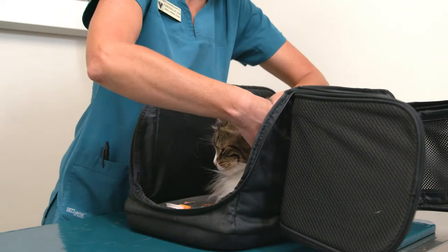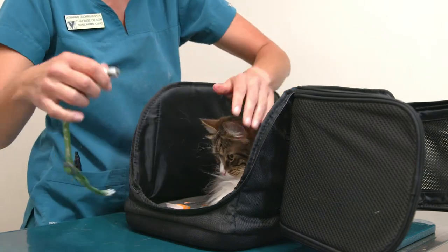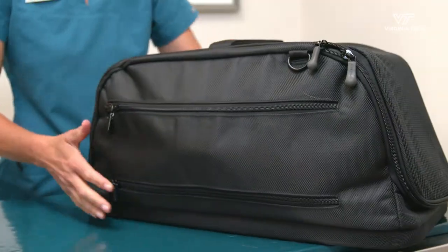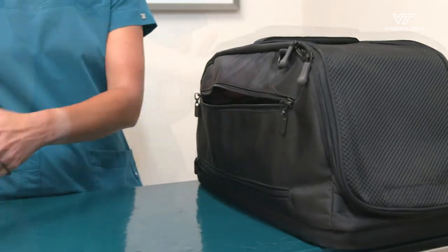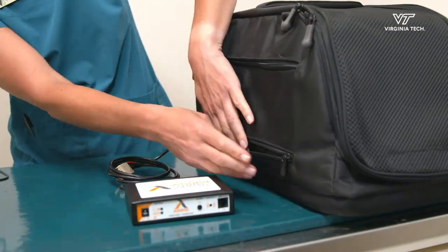Lastly let's show you how to perform a PEMF treatment. Place your cat in the carrier, take off their activity monitor, and set it aside. Then make sure to zip all the sides on the carrier so your cat is secure. Everything you need is in the pet carrier side zipper. You should have an AC adapter, a CC device box, and a cord which is attached to the loop inside the carrier.